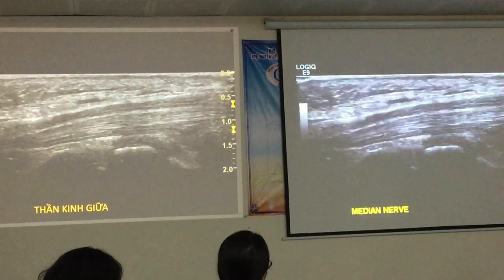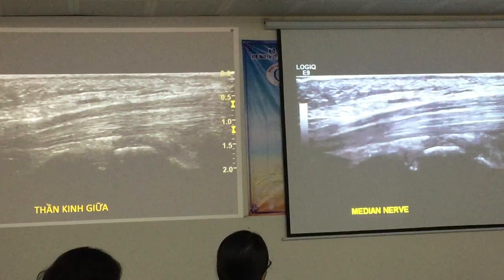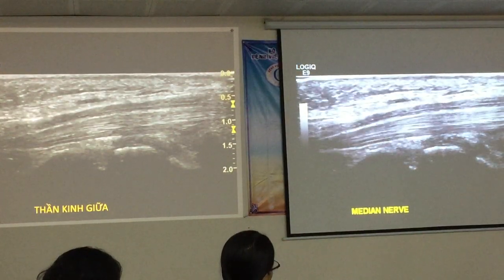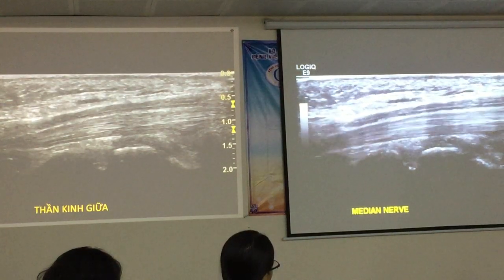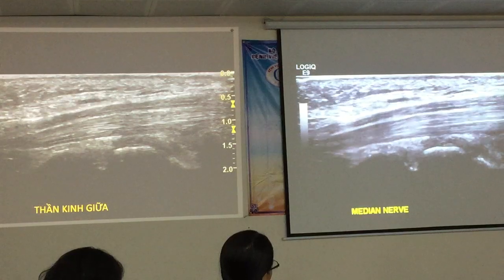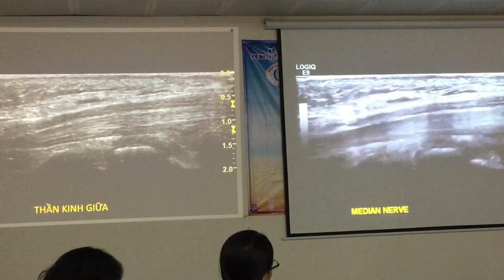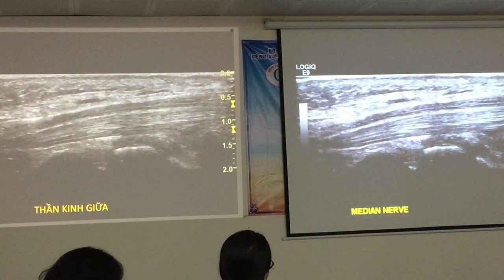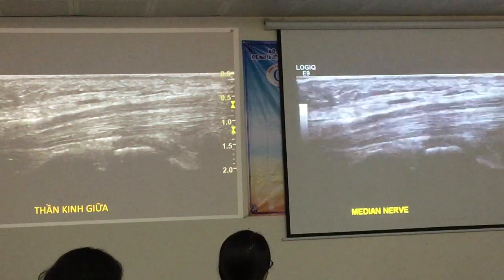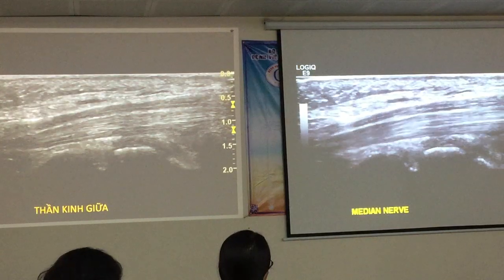Yêu cầu bệnh nhân gấp duỗi các ngón tay nhẹ nhàng để khảo sát sự di chuyển của gân cơ và thần kinh. What we sometimes see in this plane is this is the retinaculum here. When you get them to move their fingers, that is adherent underneath the retinaculum, so it doesn't move. Đôi khi mình sẽ khảo sát thấy được bệnh lý của cái mạc giữ gân gấp là gây dày lên, là gây hạn chế cái sự gấp duỗi ngón tay của bệnh nhân.